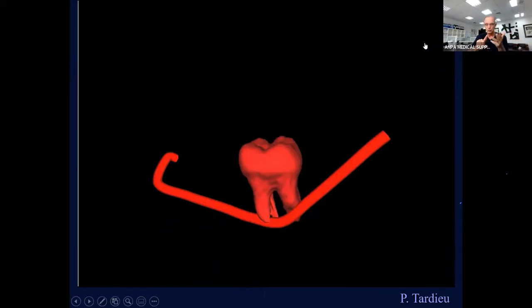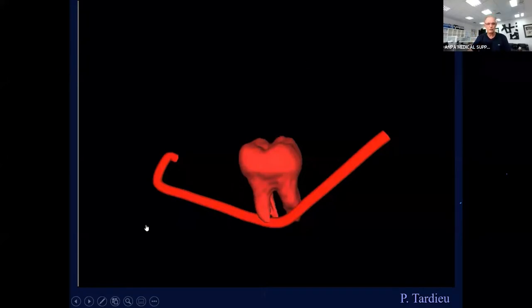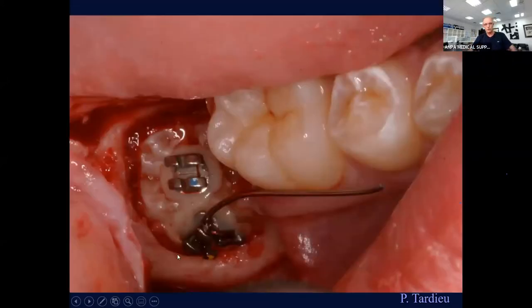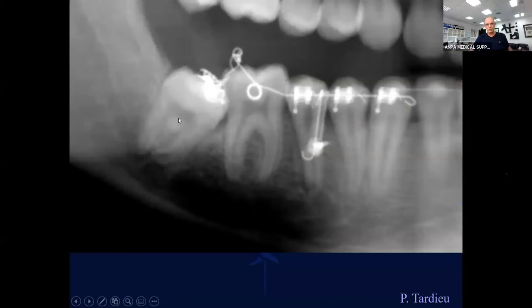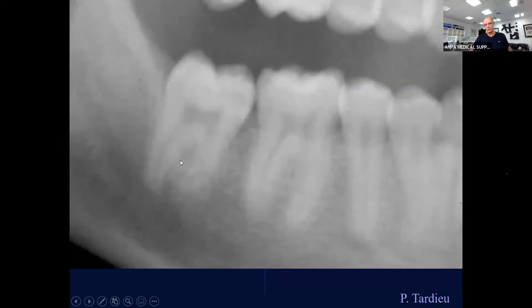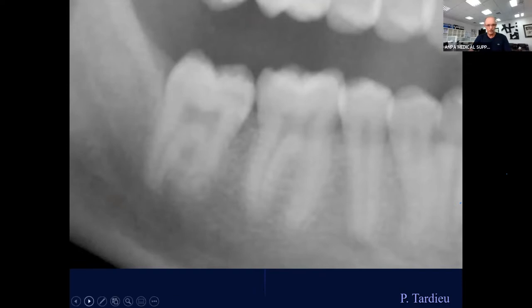We converted from 2D to 3D and made a segmentation — a mask of the impacted tooth. Knowing the relationship with the nerve, we elevated a flap, placed two orthodontic buttons, and the orthodontist pulled the tooth into alignment. The procedure was done safely with no risk of damaging the nerve. This is the way we work and the way we avoid making mistakes.